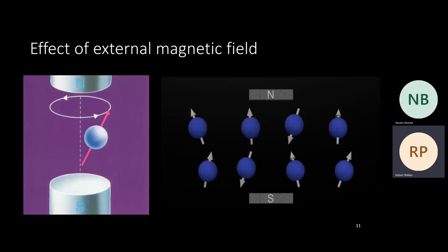This motion is called precession. And now they are happy that we have another, transverse magnetization. It is not aligned with the external magnetization. So maybe we can extract that magnetization and create the image.